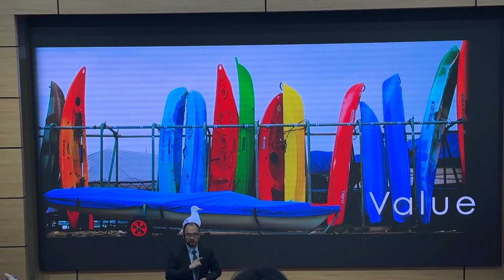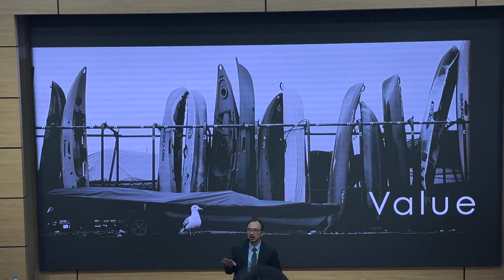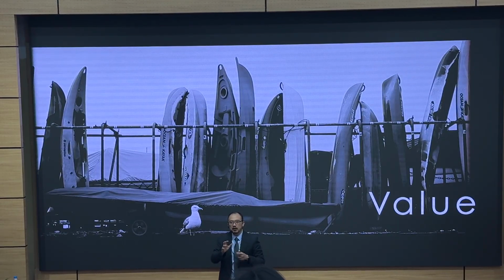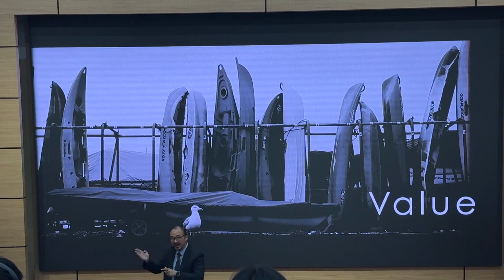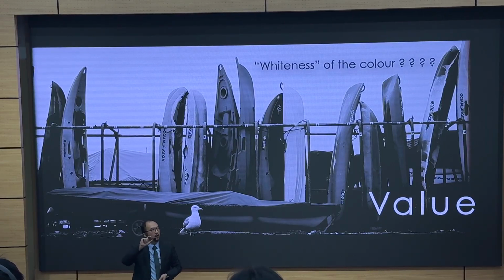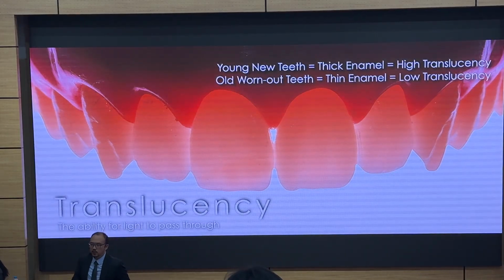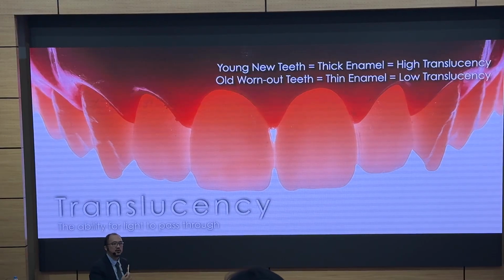And this is where value comes in. Value is a little bit hard to describe because value describes the whiteness of the tooth. Now, we don't fully know how to measure this, okay? That's why it's not even in the Vita shade guide. You can rearrange the Vita shade tabs according to value, but it doesn't really tell us much. So rather than thinking of the word value, I want you to consider translucency. Because translucency is directly proportional to the value that you get on the tooth.